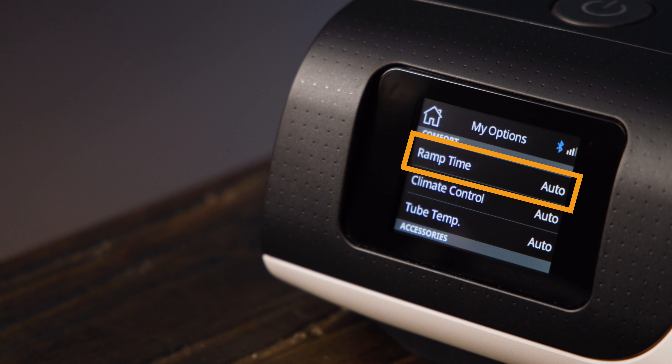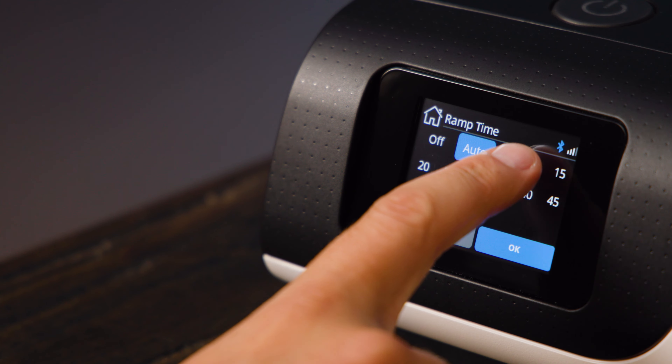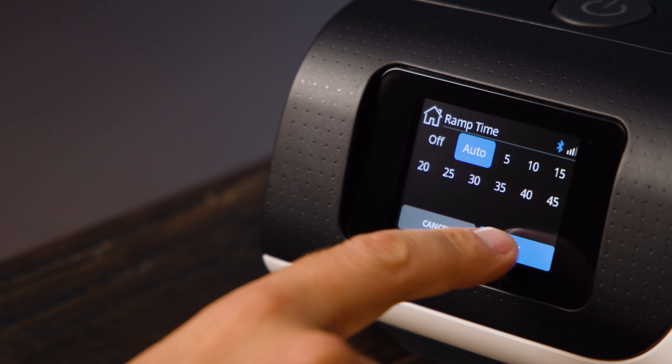Ramp is a feature that allows your therapy pressure to start low when you first turn on the unit and then ramp up to your prescription level once you're sleeping. This can be manually set to occur over a selected period of time, or as we recommend, left on auto. In auto, the CPAP keeps the pressure low until it detects that you're asleep and then ramps up the pressure, keeping things more comfortable while you're drifting off without negatively affecting your therapy.